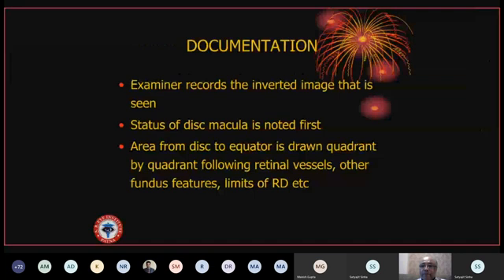Again, there is a question here by Dr. Anubhav Hire: what is the correct position to stand to examine the supratemporal retina? Diametrically opposite would be inaccessible. I do not agree with you. Why not? On any chair, in any proper position of the examination, where the patient lies or sits, you should be able to go around all the sides. There is no question of inaccessibility. If it is inaccessible, you cannot examine that area.